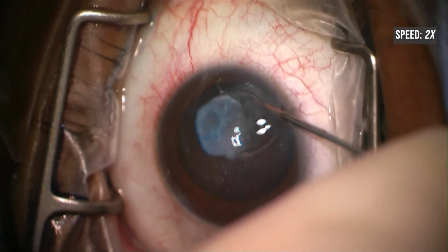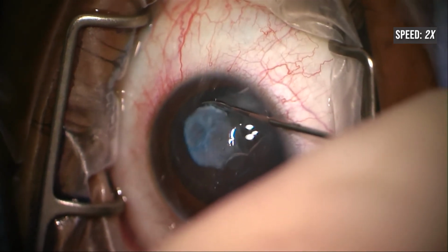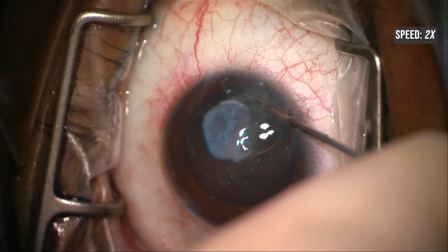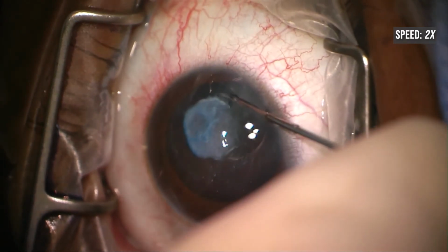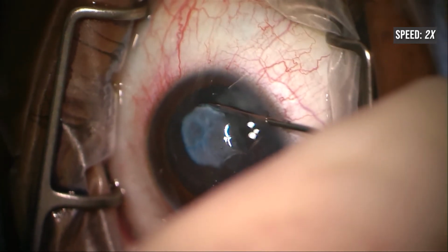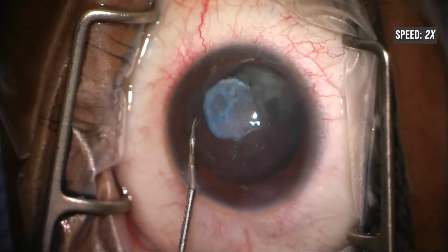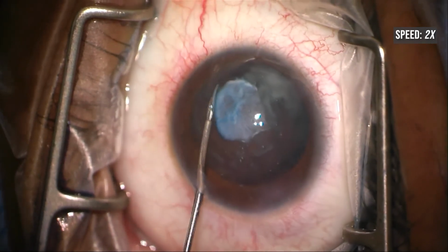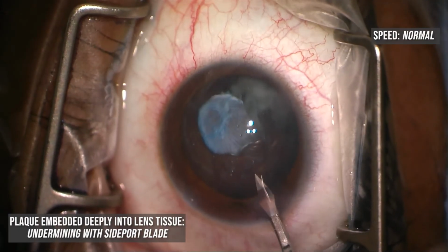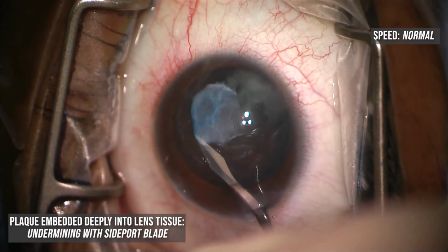And this is another paracentesis I don't believe I included in the video when I made it, but that was my second paracentesis superiorly, which allows me to have access up here. I think a good teaching point is to recognize that it's legitimate to make extra paracenteses so that you can actually reach what you need to, rather than fight and struggle to make suboptimal incisions work. First, try to make incisions that are optimal, and if those don't work, then add additional thoughtfully placed incisions to make the process work.